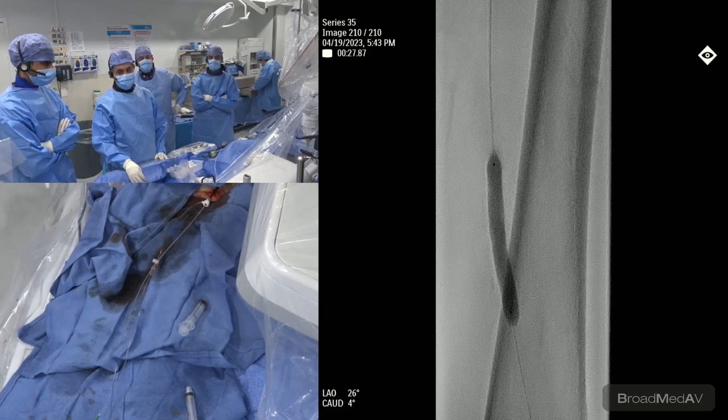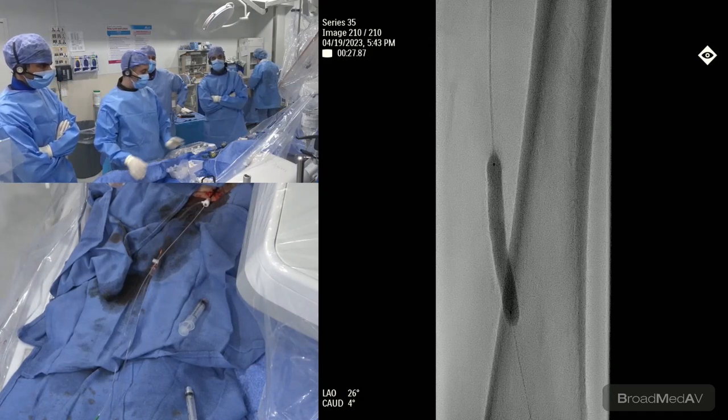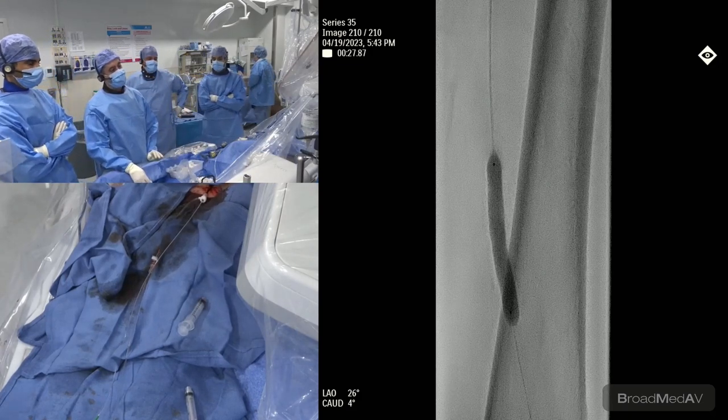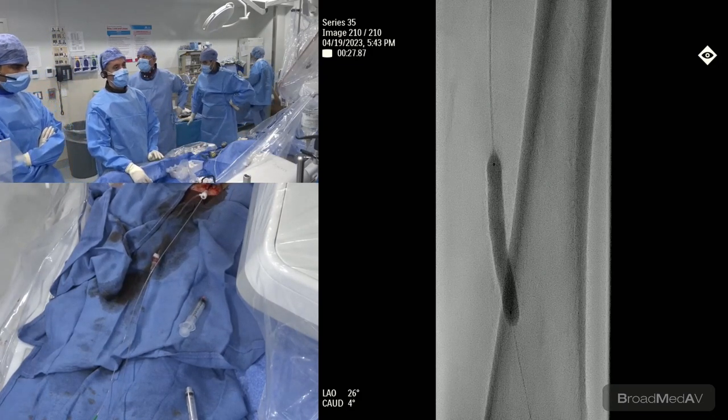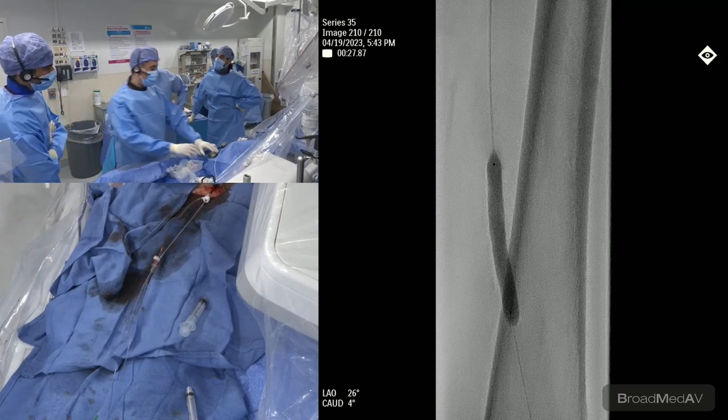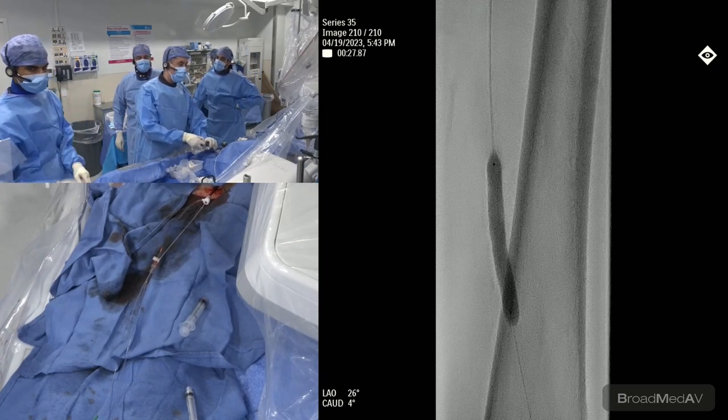So what we're going to do is probably end up stacking it, which will allow us to do it. But don't open it until we take a picture, please. Yes, sir. We leave it up for about 3 minutes. Is that 3 minutes, Michelle? Almost, another 20 seconds left.